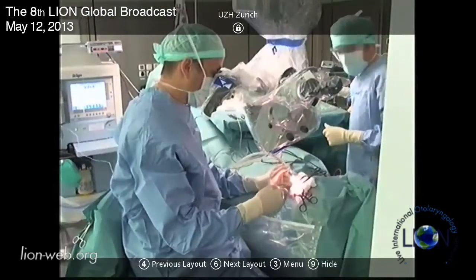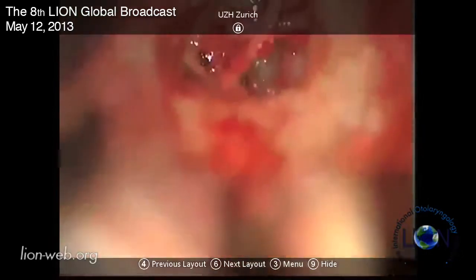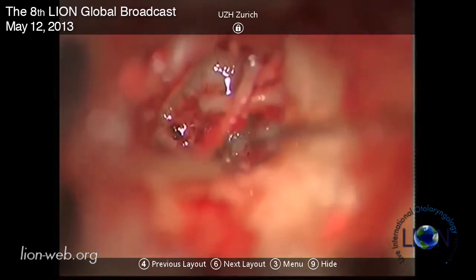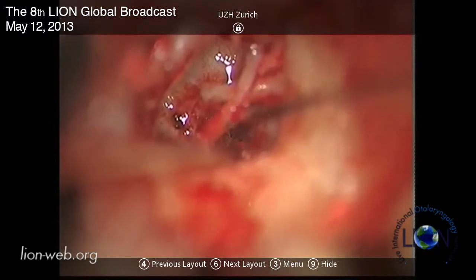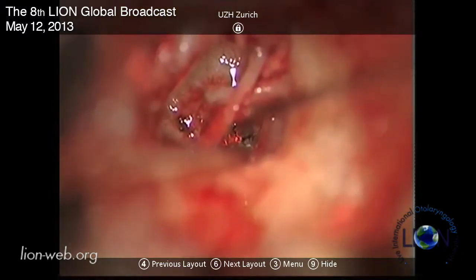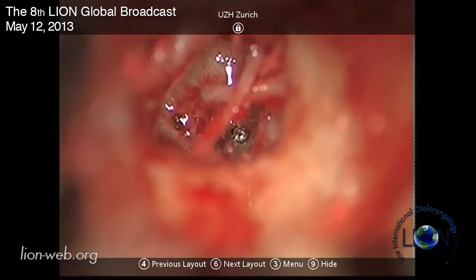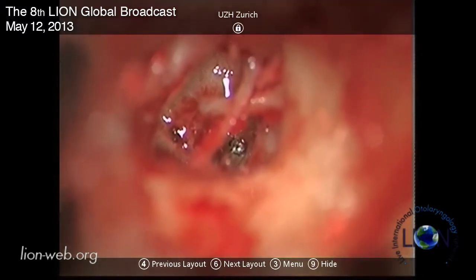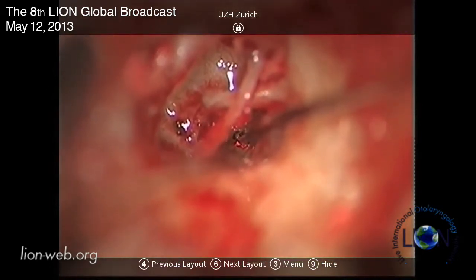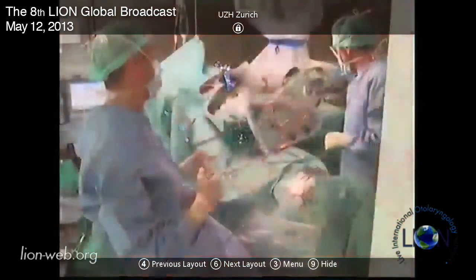I've measured so it's going to be 4.5mm and there's good enough space to put a 0.6 prosthesis inside. I make a few laser shots on the footplate. I'll try to be a little bit posterior-inferior from the center. For the footplate the setting is 0.5 watts actually. I have a filter so I don't see the green flash. Now it's open.